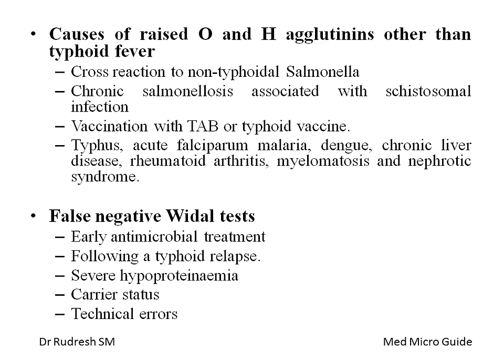False negative Widal results can occur if treatment is started early, as this prevents the full immunological response and decreases titers. Following a typhoid relapse, immunity is weakened, reducing antibody production. Severe hypoproteinemia, carrier status, and technical errors can also give rise to false negative Widal results.